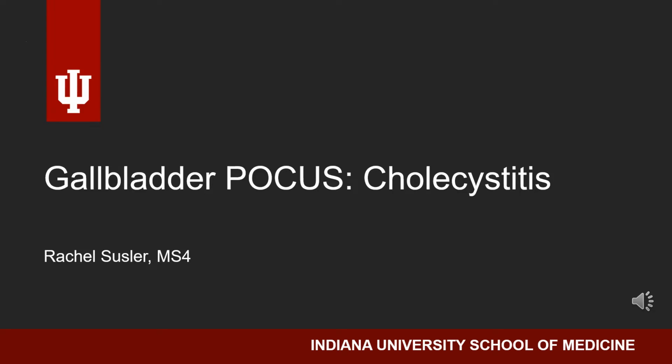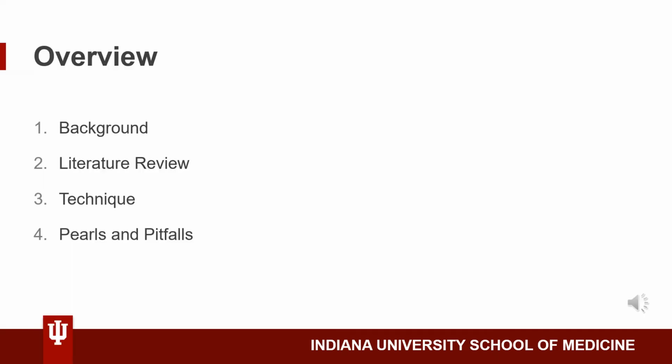In this video, we will be talking about gallbladder point-of-care ultrasound with a focus on cholecystitis. A quick overview for this video. We will first go over some quick background information, then we'll jump into literature review of POCUS and cholecystitis. Then we'll review the technique on how to visualize the gallbladder, and then we will cover a few pearls and pitfalls with POCUS in regards to cholecystitis.